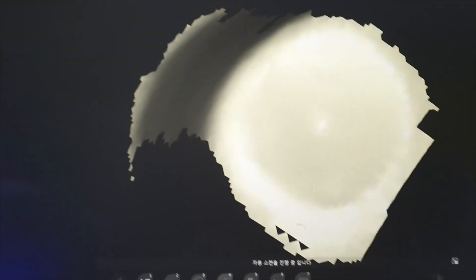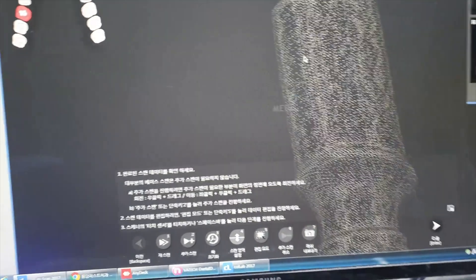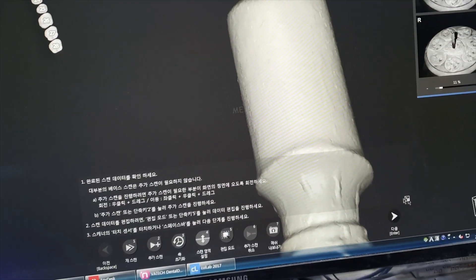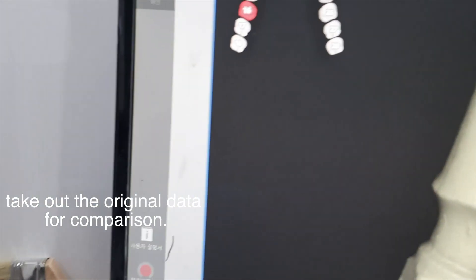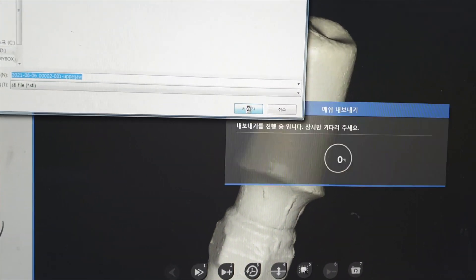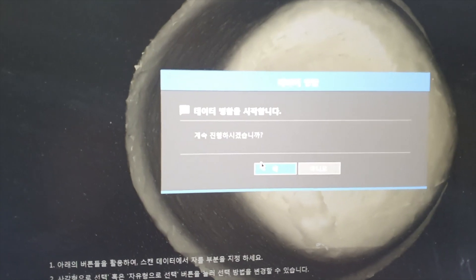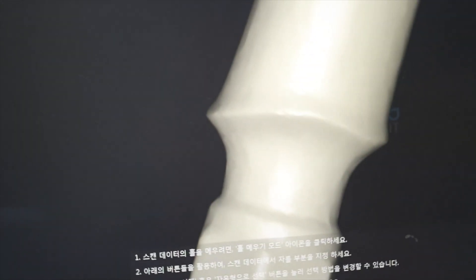I did the scan with the Medit scanner. Can you find some bumpy areas? I need this original scan data for comparison. So I use the mesh export function — it's number seven. And then I did auto calibration. As you see, now we've got a fine surface of scan data.